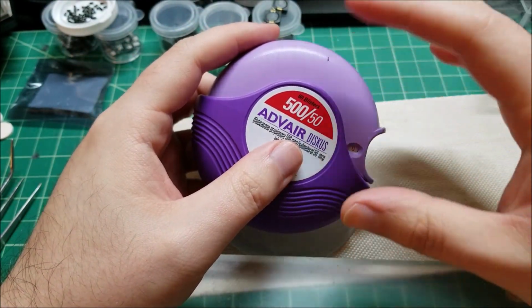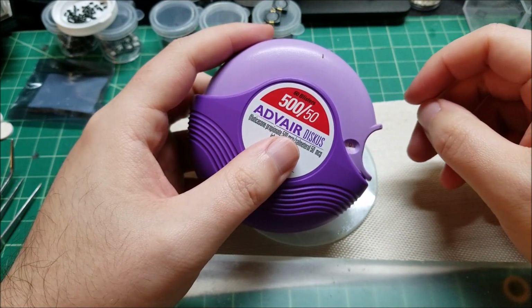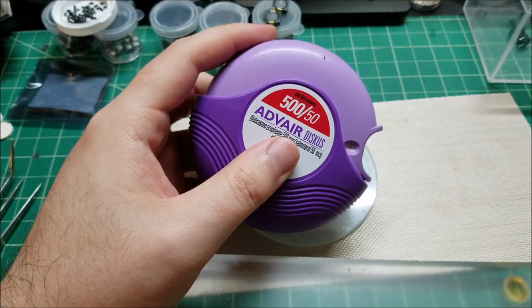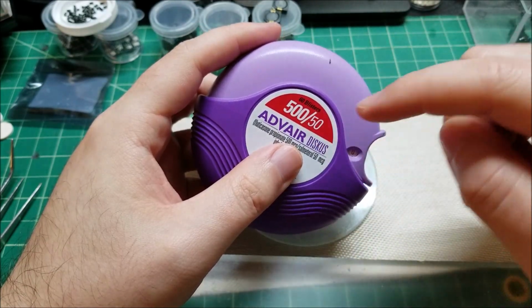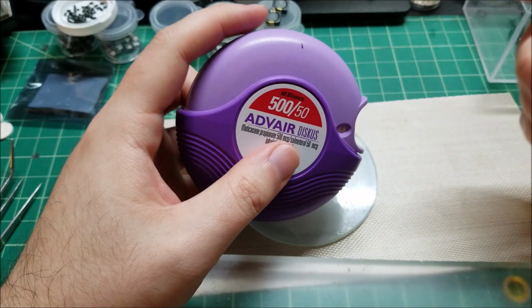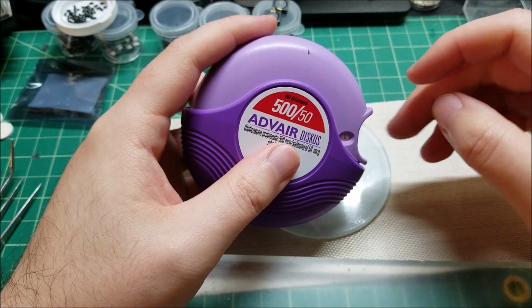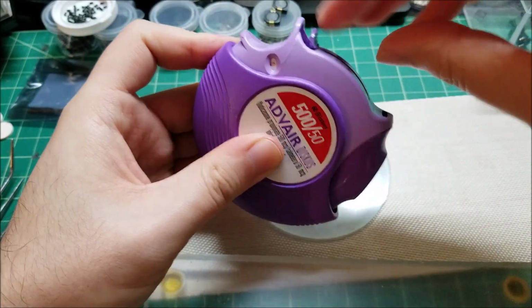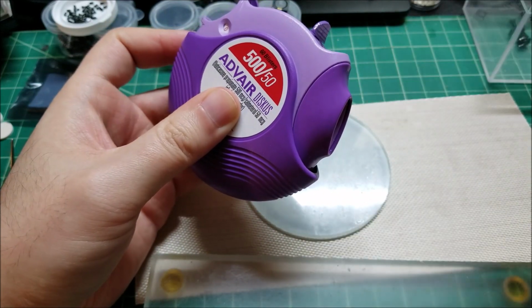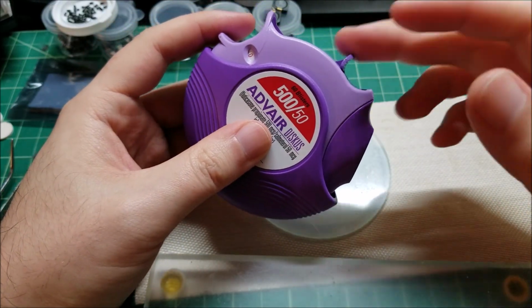I really don't do a lot of medical related videos. It's not really something I've gotten a chance to do before. But my mom has asthma and she has one of these Advair Diskus thingies. Basically this is like an inhaler, and when she gets an asthma attack, she'll open it up and I think you prime it or something, and then you breathe in and it gives you medication, basically like an inhaler.